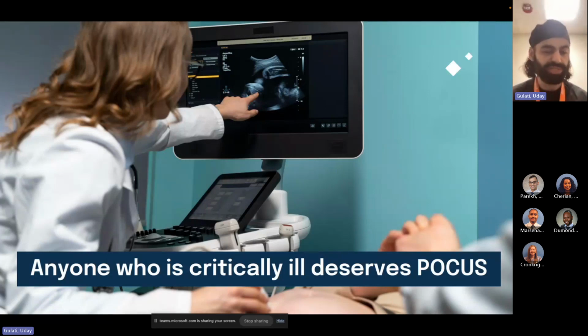And what I've seen more and more, especially as our population landscape changes, is that sometimes these views are very hard to get. They're very difficult to do. And that's not even including the patients who are post cardiotomy, who have all this air in their chest from getting these devices and having an open chest. It's almost impossible to get an accurate view of the heart, because once again, air is ultrasound's worst enemy. And the only way to get a good picture is to go from behind through the esophagus.